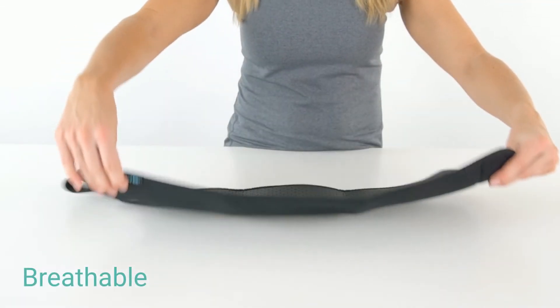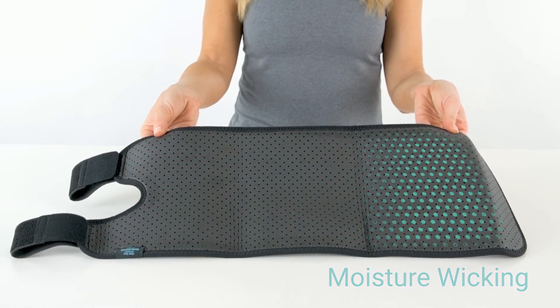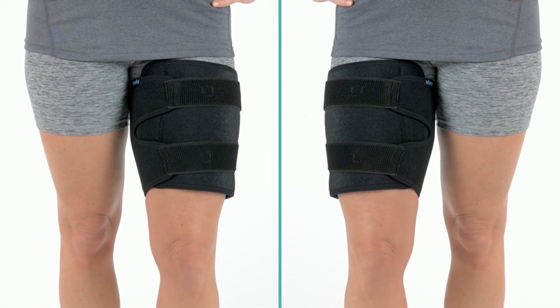The breathable design wicks away moisture and includes small ventilation holes, perfect for any activity. The unisex wrap can be worn on either leg, over or under clothing.